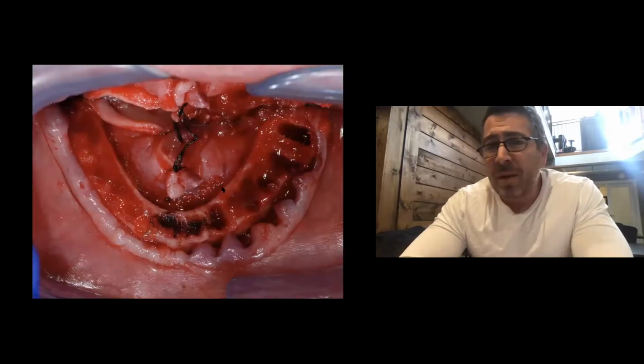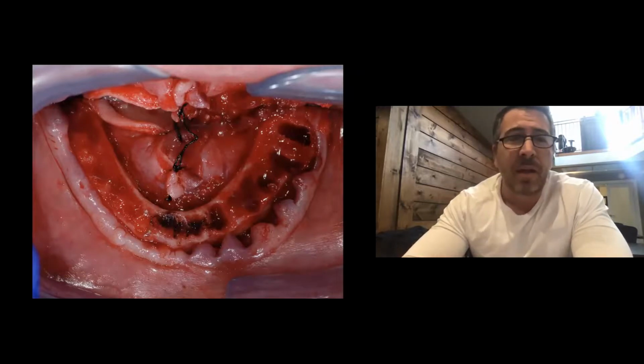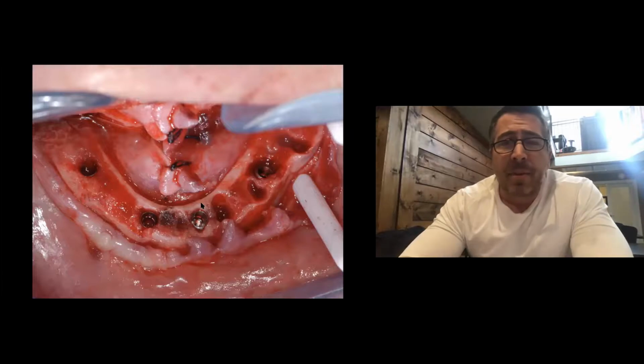So you do it all. You don't just treat the implants. You don't just take the teeth out. You treat the problem. So by looking at the photos and doing the proper diagnosis, you can come up with an action plan, as Azim mentioned with respect to the whole surgical procedure. You place your implants, you suture it up, you let it go.